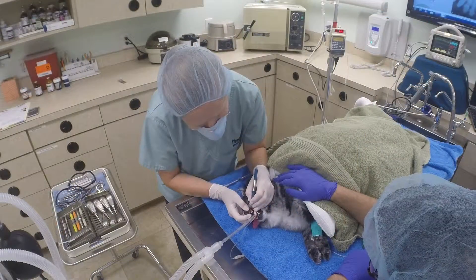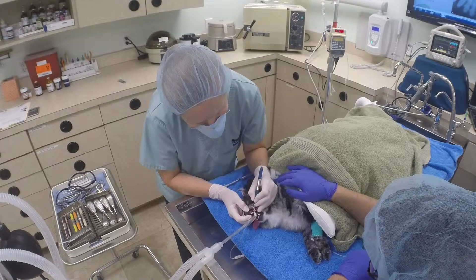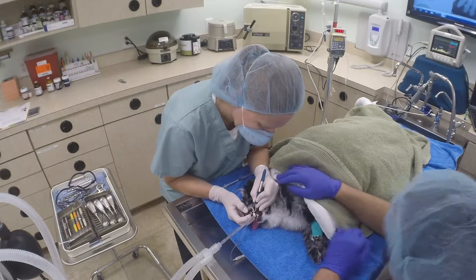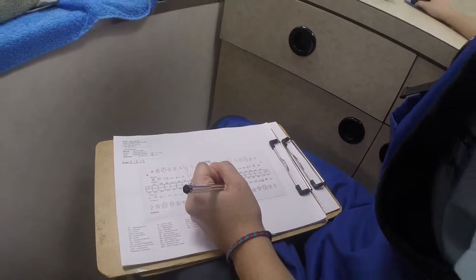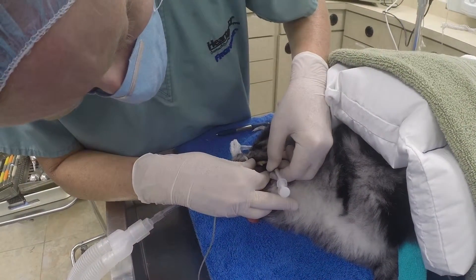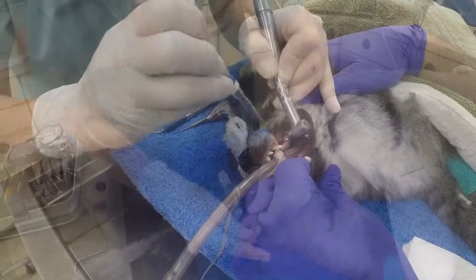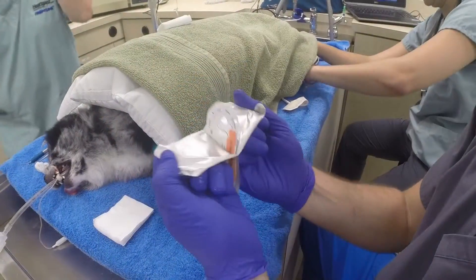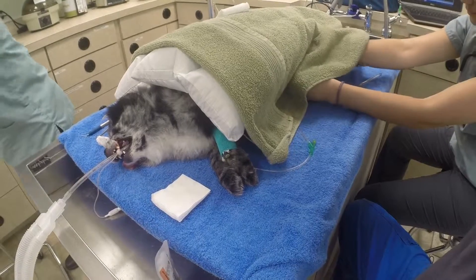The teeth are probed, any pockets identified, and findings are compared to the x-rays. These findings are then charted or recorded in the animal's chart. If a tooth is identified that needs to be extracted, a nerve block is applied and then we use a high-speed water-cooled drill to remove the tooth.